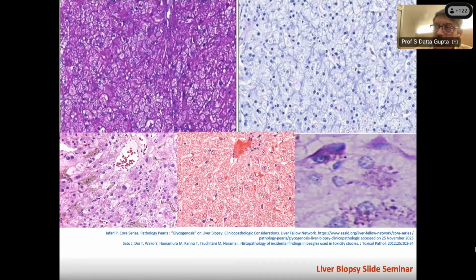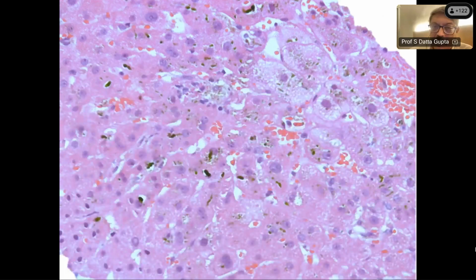That is because of oxidation of lipids, as the cell turns over and becomes old, you see it. They are PAS positive, AFB positive, and so on. They are granular, like this. So lipofuscin is a common pigment. It's not iron. Please be careful while seeing that.